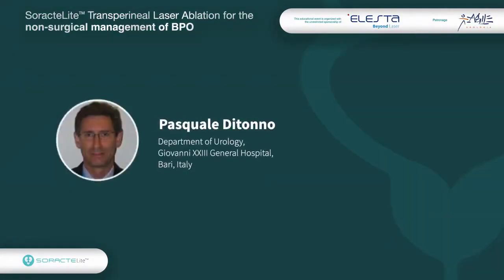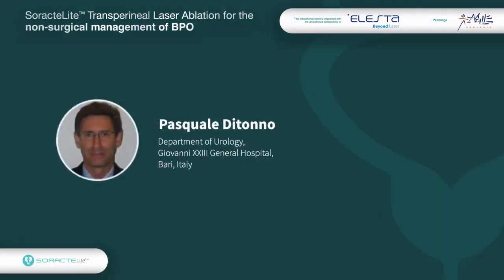And another question is maybe for Professor Di Tonno. Can you tell us something about PSA and TPLA? How does the PSA move after the procedure? Okay. Yes, we test the PSA after a couple of weeks from the procedure. There was an increase in the PSA, but at 3 months we go back to baseline and below the baseline. So it can be a parameter to check prostate volume also. And it follows exactly what happens when you have prostate inflammation, prostatitis: you have an increase in PSA and then it falls down.